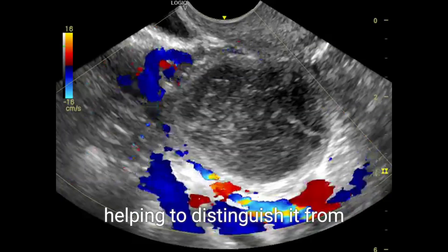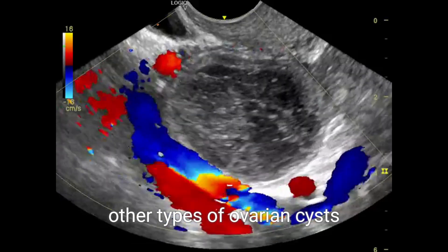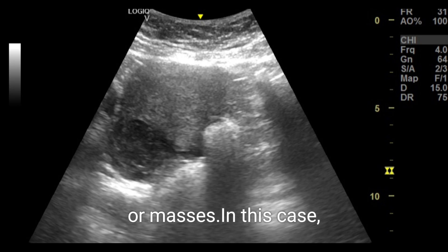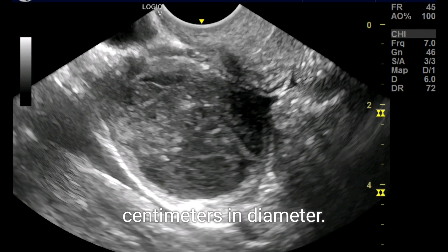This helps to distinguish it from other types of ovarian cysts or masses. In this case, the cyst measured about 4 centimeters in diameter.